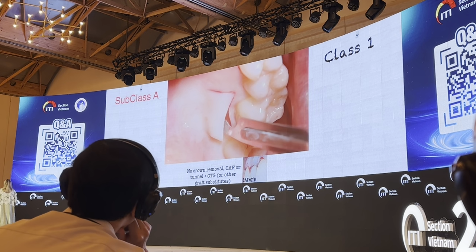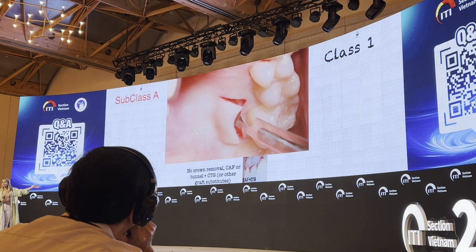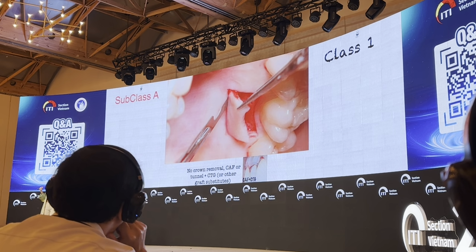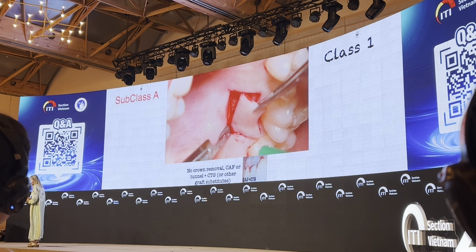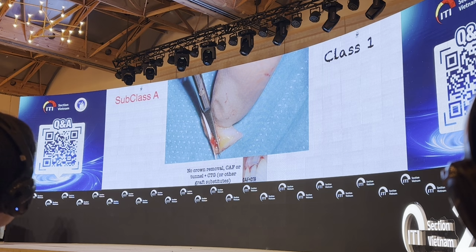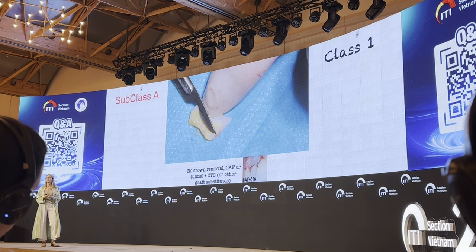So now I'm in the palate. You will see only this harvesting procedure. This is the free gingival graft with a desepithelialization in a second step. No other alternatives on my end. This is the easiest surgical procedure on the palatal side, the safest, and the one that allows me to obtain the best quality of connective tissue, because I'm harvesting the connective tissue which is immediately subepithelial.